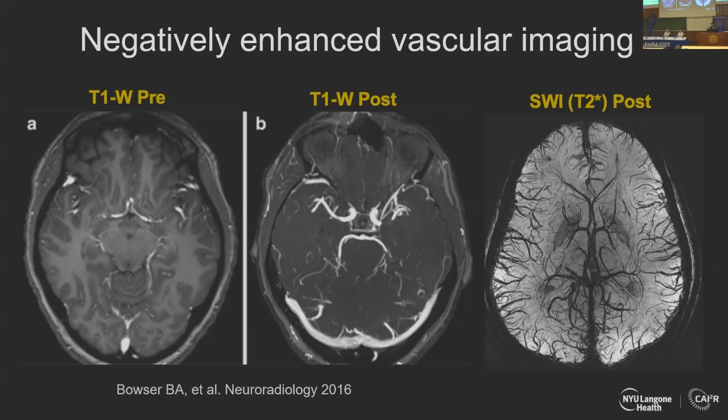First of all, T2 star weighted imaging has a strong blooming effect, especially with this iron-rich contrast agent. As you can see here, it's very good for small vessel detection compared to T1. The second is that gradient echo allows higher resolution in similar time compared with T1, and this is particularly useful for the higher field, 7T.